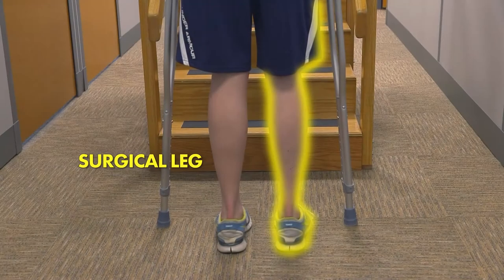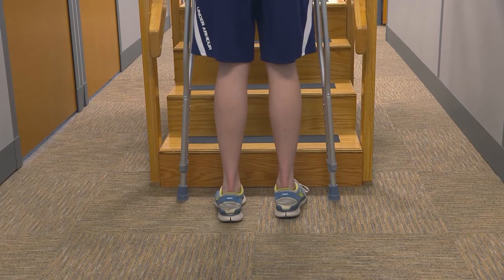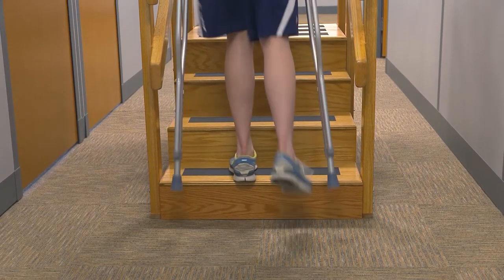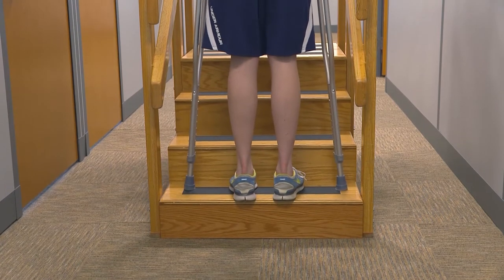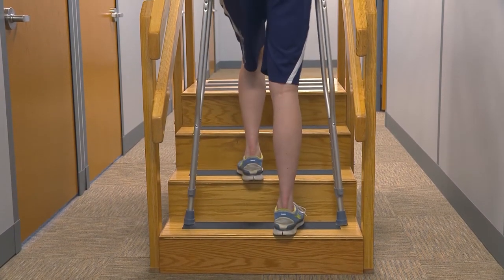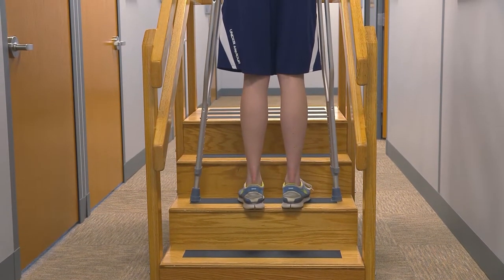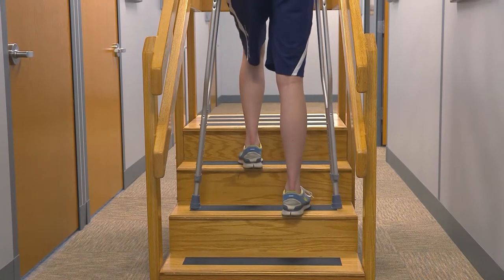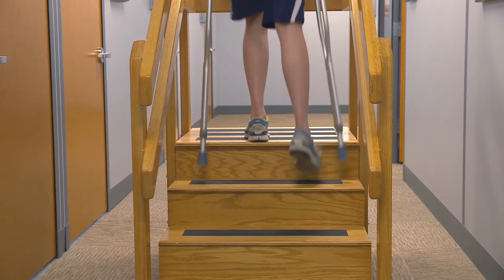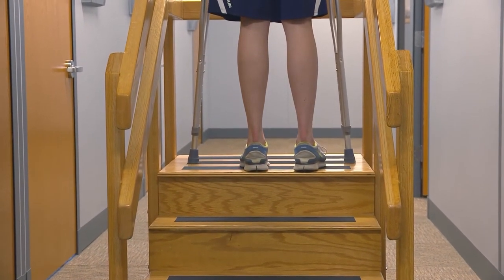When going up the stairs, start close to the bottom step. Place the weight through your crutches and step up to the next step with your non-surgical leg, followed by your surgical leg, then the crutches. Maintain your weight-bearing status while advancing to the next step. Make sure your feet are shoulder-width apart to assist in balance. Repeat the sequence: non-surgical leg, surgical leg, crutches. Remember the saying: up with the good.